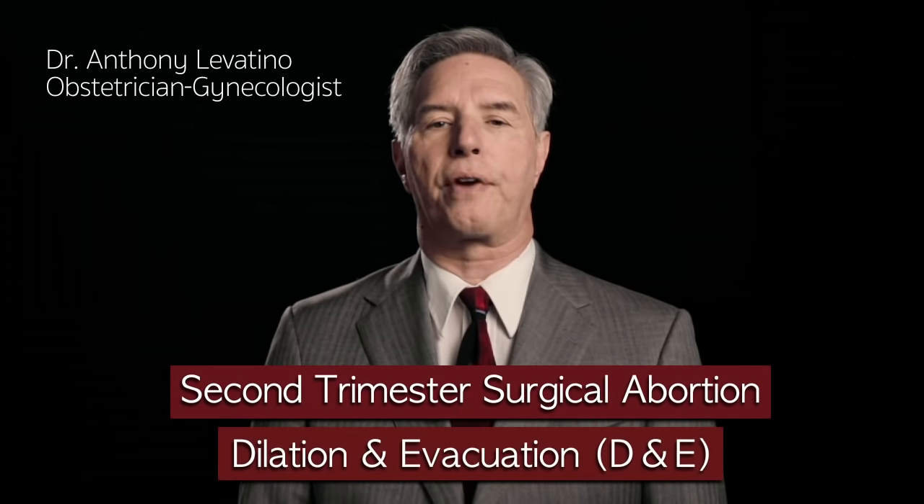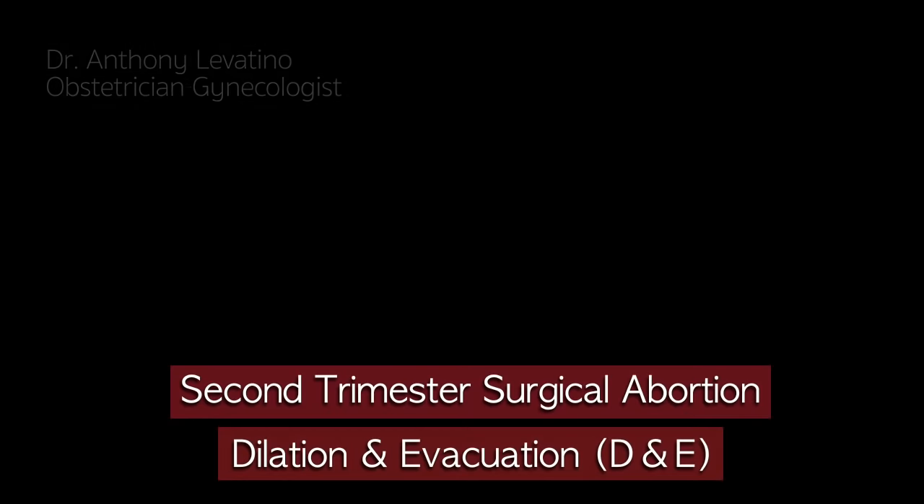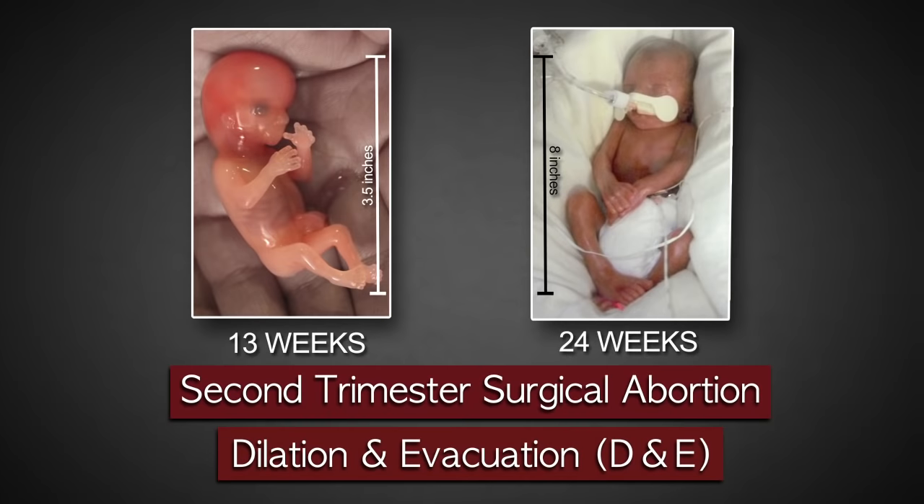My name is Dr. Anthony Levatino. I'm a practicing obstetrician-gynecologist, and I've performed over 1,200 abortions. Today I'm going to describe a second trimester surgical abortion called dilatation and evacuation, or D&E. A D&E is performed between 13 and 24 weeks of pregnancy.